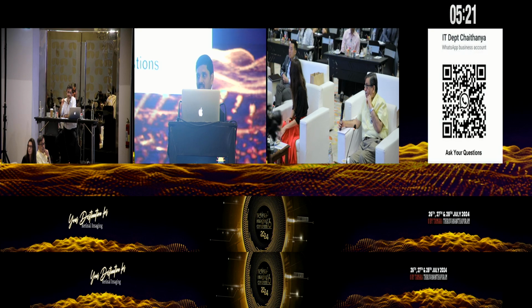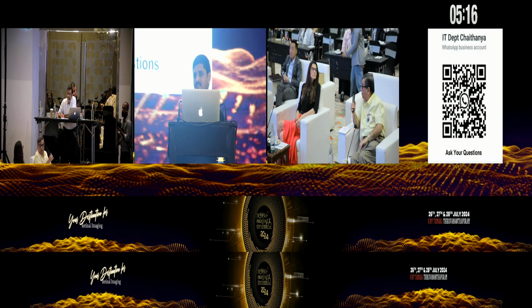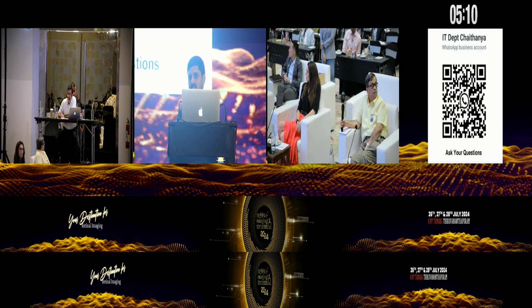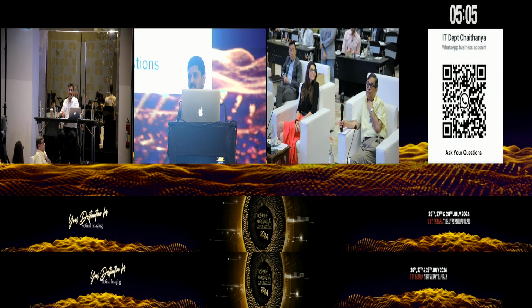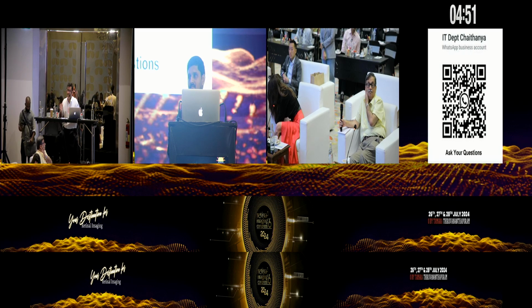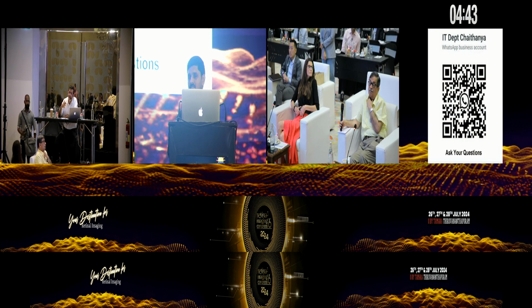Could I ask, how frequently would you follow up these patients? Because once you see the DLS, you know that there will always be a time when it gets active. I personally, if I see the presence of DLS and GA, these patients mostly come for their fellow eye, so we are keeping an eye on that. If both eyes are still dry and they have DLS with GA, I usually call them in 2 to 3 months, but I mostly do telemedicine, so they get their scans done, and they are more vigilant about changes in their visual function. So around 2 to 3 months.